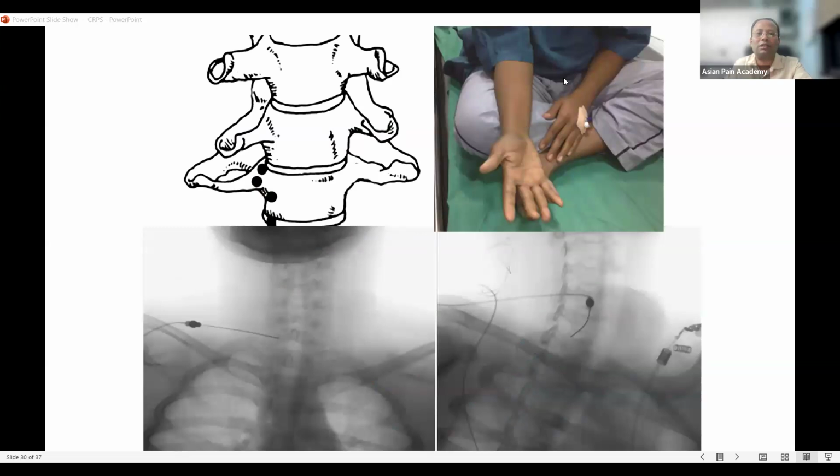This patient, so this is the young boy. Now he has become all right after giving the diagnostic injection. Then I did radiofrequency ablation of the stellate ganglion under X-ray. Under X-ray, I did the ablation. I did not try under ultrasound.